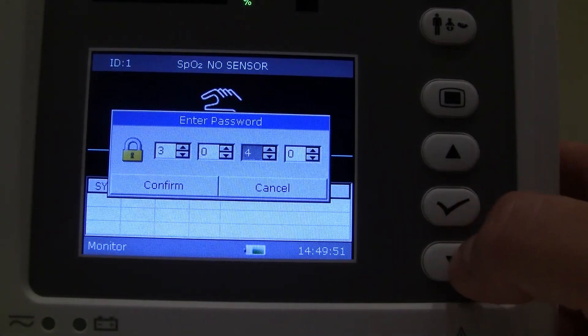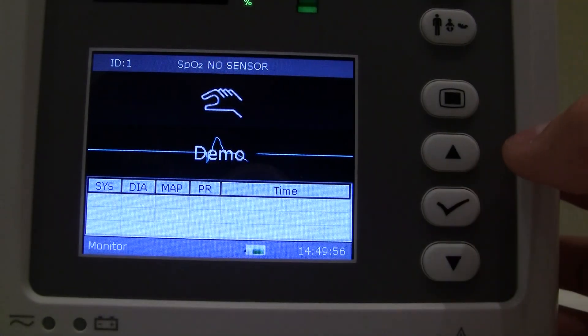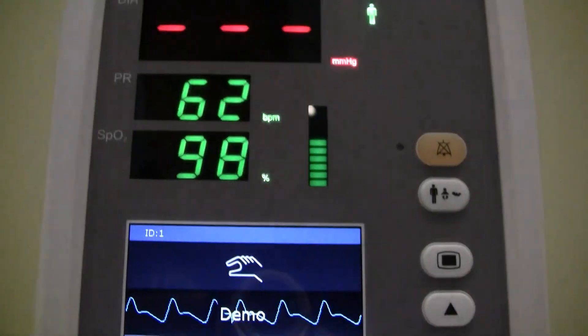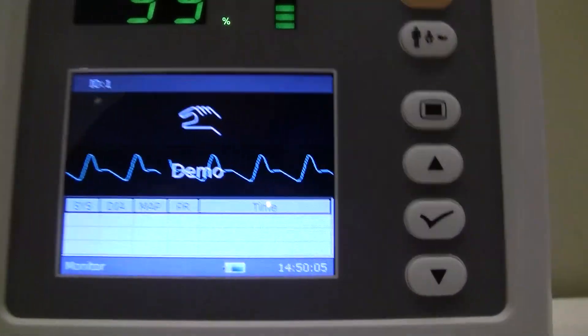You can go ahead and put this into demo mode. The demo password is 3045. You hit OK and you can see that we're in demo mode — it clearly says so on the screen and gives us some readings to confirm that we're in demo mode.